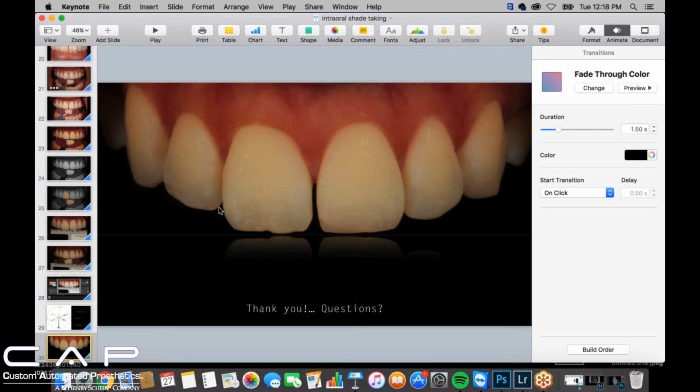Once that blood comes back, because you have to remember too that blood runs through the pulp of the tooth, so there's a lot of life in there. There's a lot of color running through there, and so when that's scared away or blanched away from the anesthesia or dehydration, all the moisture is gone. It definitely changes the shade of the tooth.